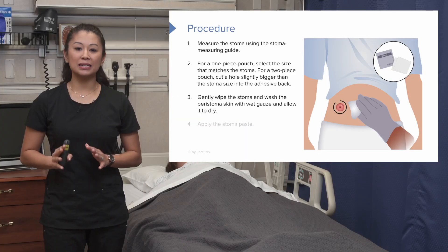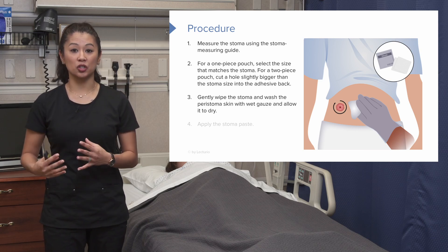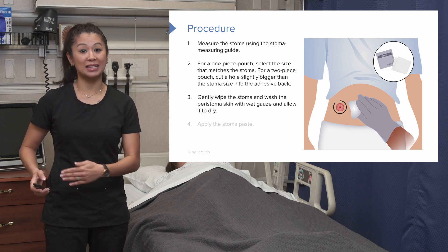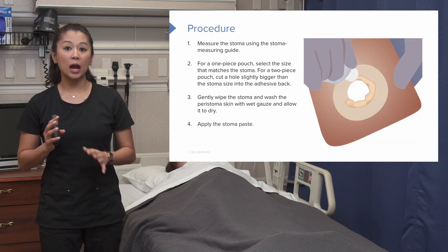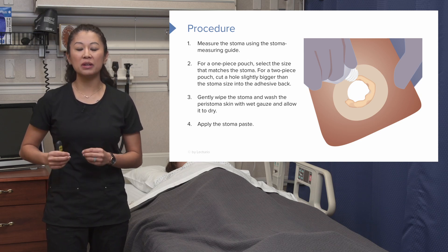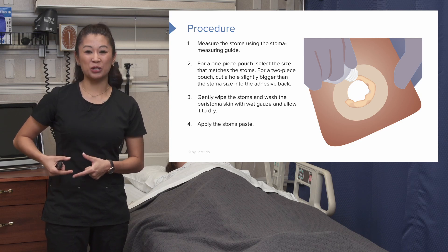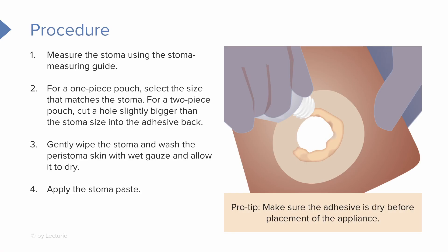It's a good idea to gently wipe around the stoma and make sure the skin is clean and dry. Key point: it's important that we make sure it's nice and dry before we try to adhere our appliance. If necessary, you can use stoma paste, which is really helpful to help prevent any leakage or fill in gaps if the appliance is just a little bit too big. If you do use the stoma paste, give it about a minute or so to dry.